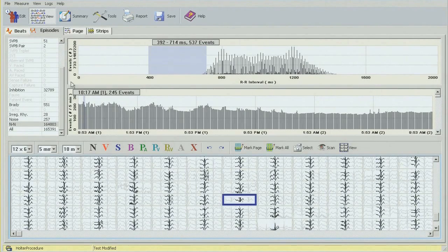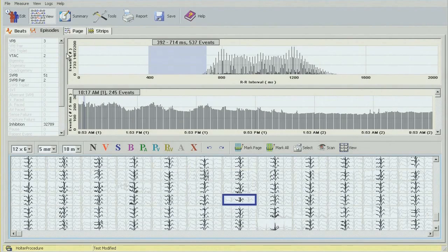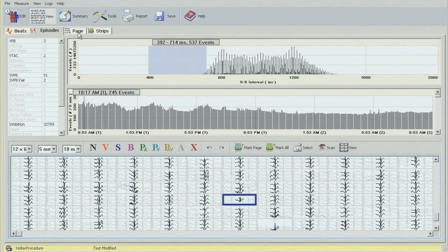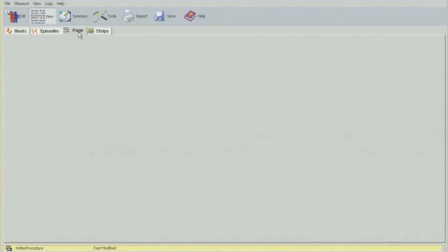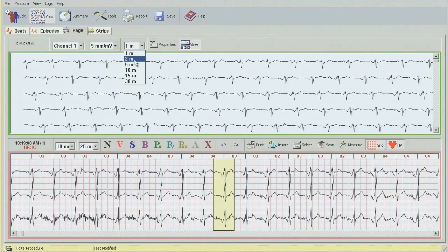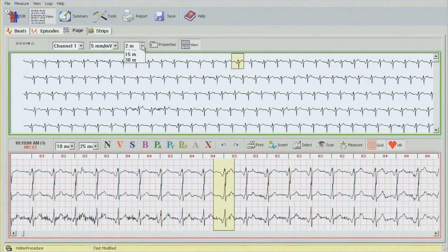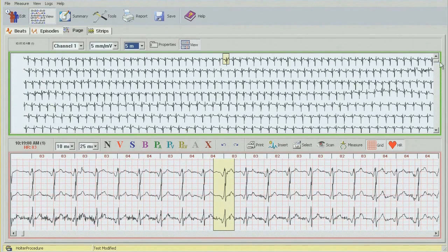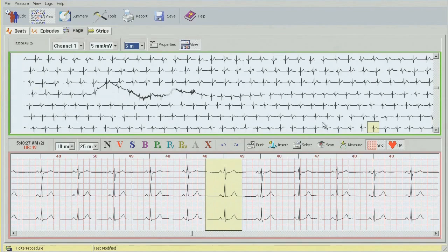At this point we're pretty much finished with our editing: three ventricular beats, two runs of VTAC, 51 supraventricular beats, two atrial couplets. If there are any diary symptoms you want to correlate with the ECG, you can do this from the page mode — changing the speed or the time interval to two or five minutes and picking the time to see what's going on in the ECG.